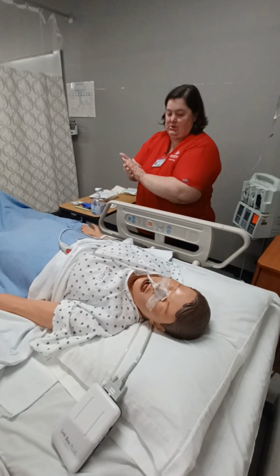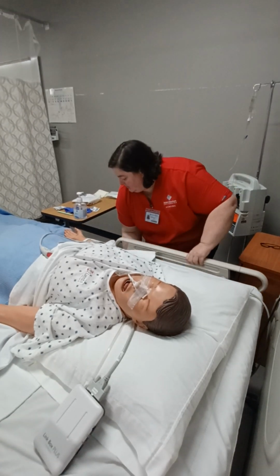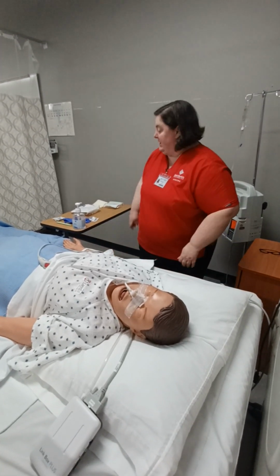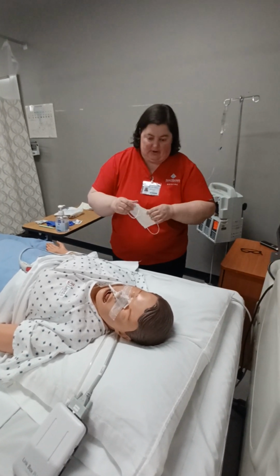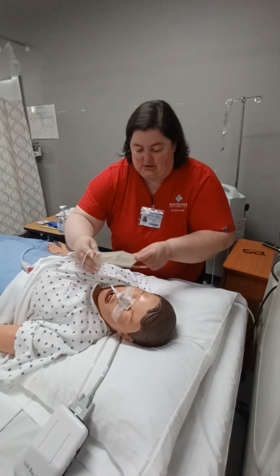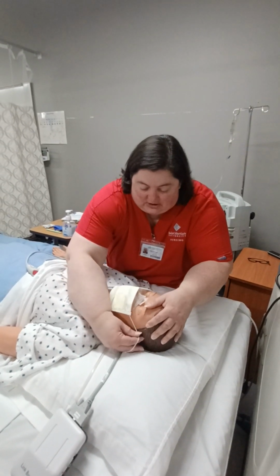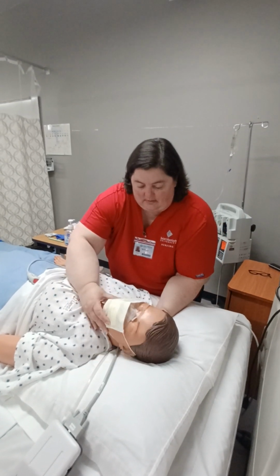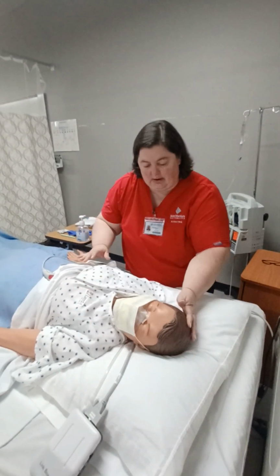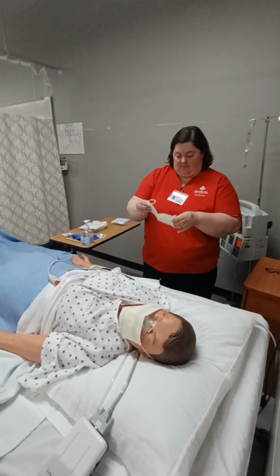Going to do hand hygiene. Going to put this down before I do hand hygiene. I'm going to put a mask on my patient. So I do need you to wear a mask during this procedure, and that's just to hopefully keep the sterile procedure as sterile as possible. I am also going to ask that you turn your head away from your dressing site and keep it that way while we do this. I'm going to put a mask on myself.